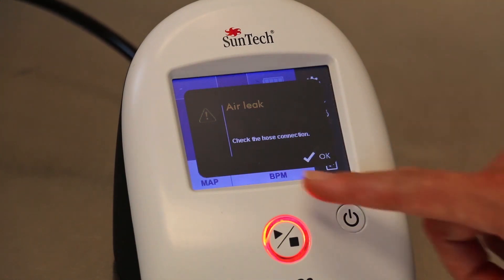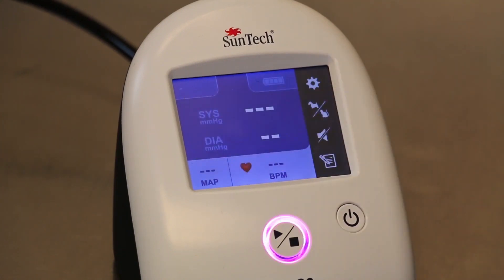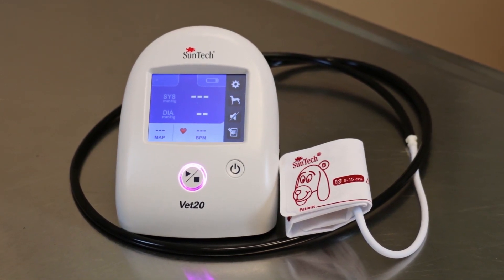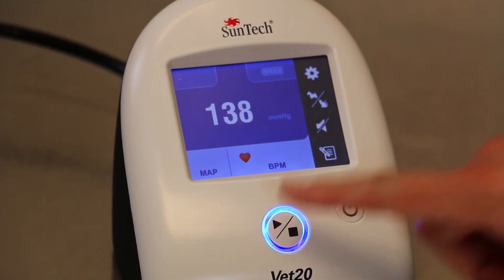If you see an error message during a reading, follow the instructions located on the screen. These messages provide information on what went wrong and also have suggestions to fix the problem. There is no need to look up an error code in a manual. If you need to stop a BP measurement, simply press the start stop button.